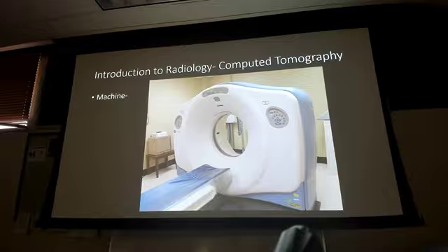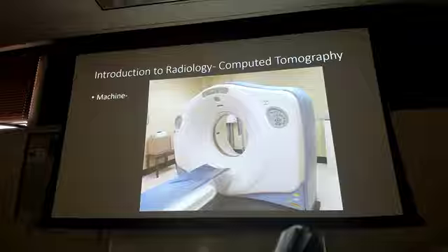Claustrophobia, right? More of an MRI issue, not a CT issue. It is open. They are very rarely inside of this thing unless you're doing a head CT, and even then we're talking seconds. These scans happen in less than a minute, and some of them less than 30 seconds once they hit the button and start.